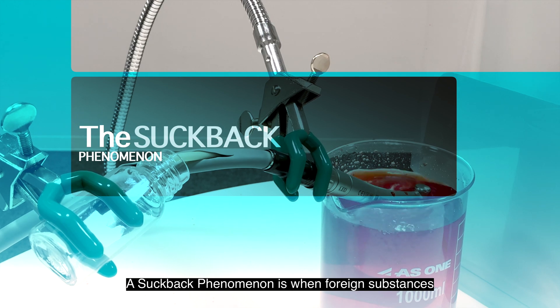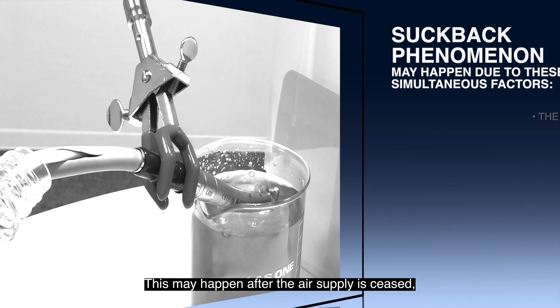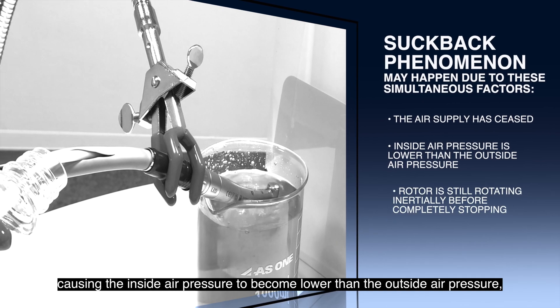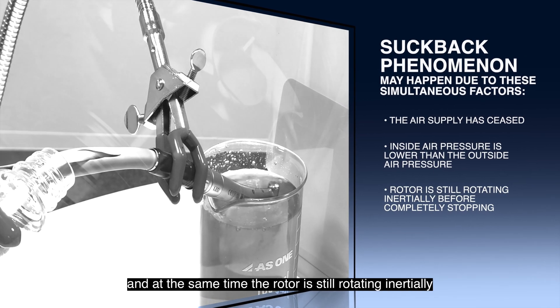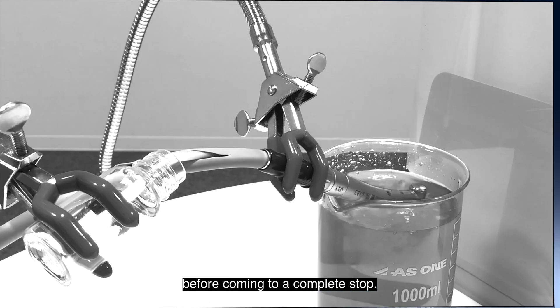A suckback phenomenon is when foreign substances are drawn into the head of the turbine for a very short time after you release the foot pedal. This may happen after the air supply is ceased, causing the inside air pressure to become lower than the outside air pressure. And at the same time, the rotor is still rotating inertially before coming to a complete stop.